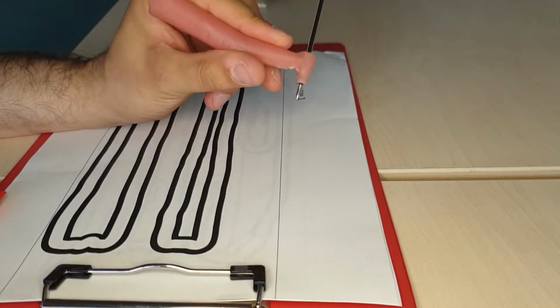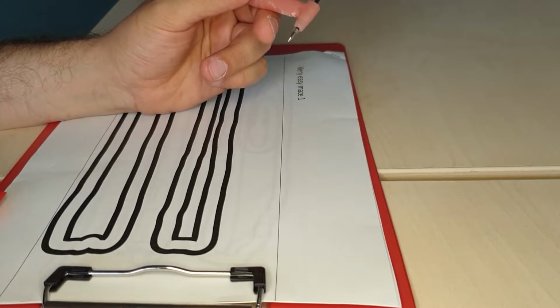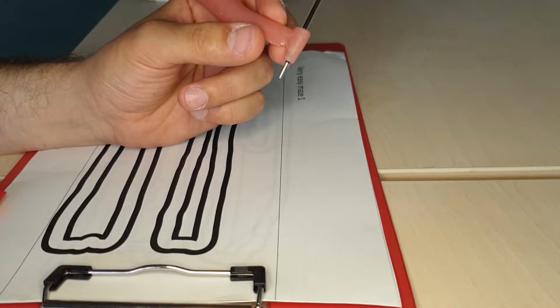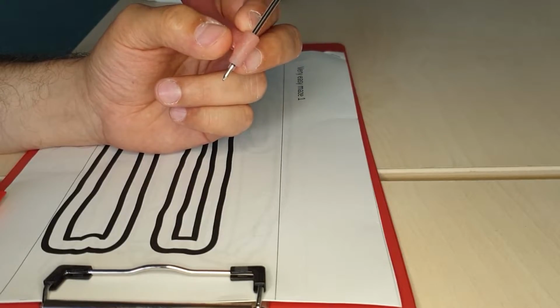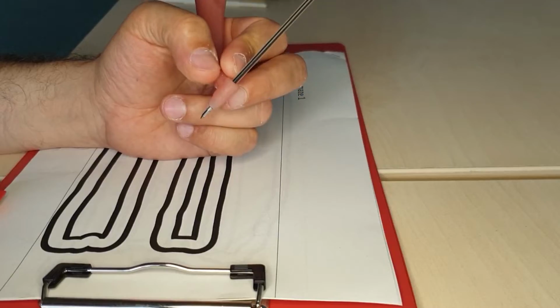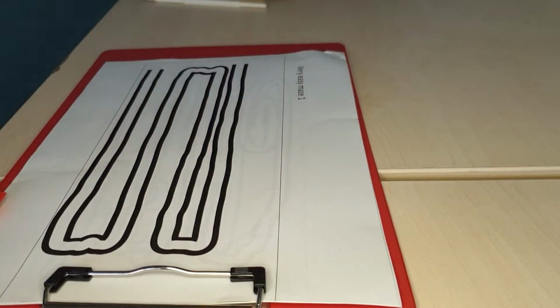Okay, so this is the current iteration of our pre-rotary instrument training pen. We developed this early on in the curriculum as a tool to train people how to hold a rotary instrument in a safe, controlled environment prior to actually using handpieces in clinical work.